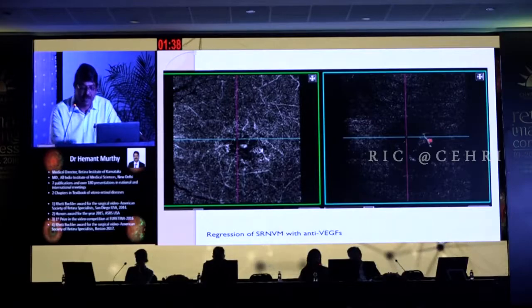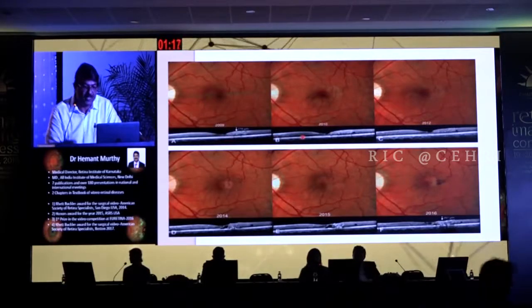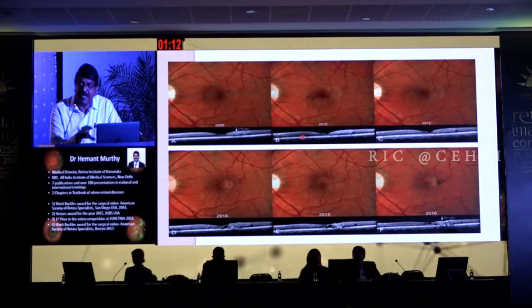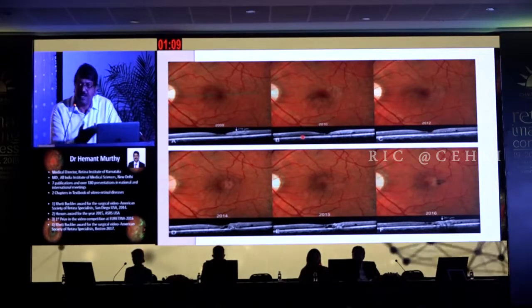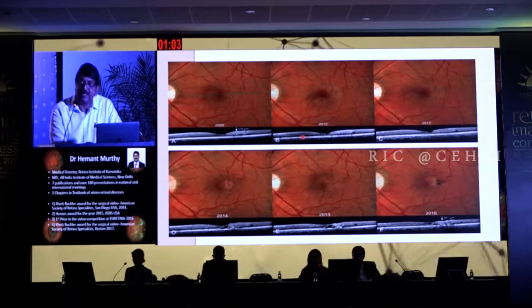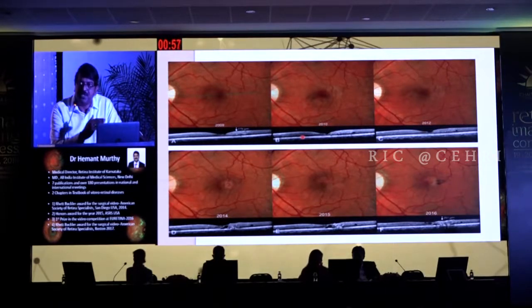This is a study by Richard Spaide, which looked at a patient from 2009 to 2016 and shows the various stages they went through, starting with the loss of the Muller cells, with the collapse of the tissue, and the loss of the ellipsoid zone in the non-central area, which progresses towards the center. There is tissue contraction in the temporal part of the macula, which leads to a change in the architecture. There is a lot of contraction of all the blood vessels. There's a right-angled venule, which then leads to the neovascular process, starting superficially and going deeper.